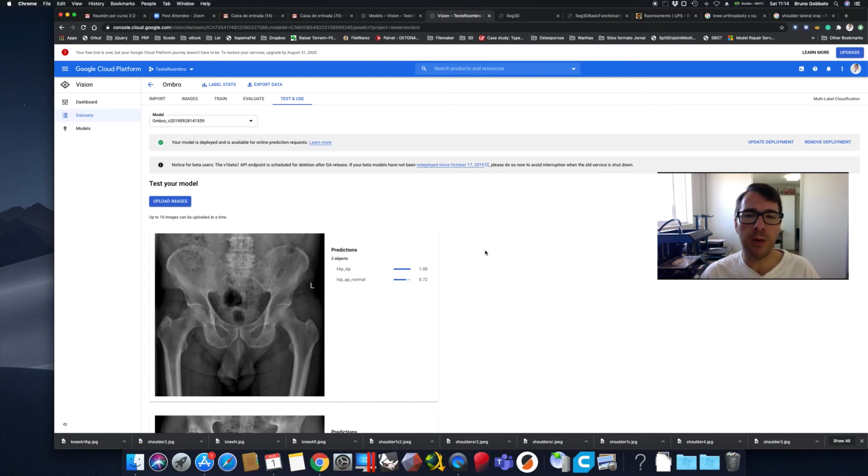We can do this with MRI, we can do this with CT, but remember that Google is not looking for a specific part of the image. It's looking at all parts of the image, and if you are interested in looking only at a specific part, we have to hope that the algorithm looks for that specific part of the image and finds that it is different or the same as the data set that it has.